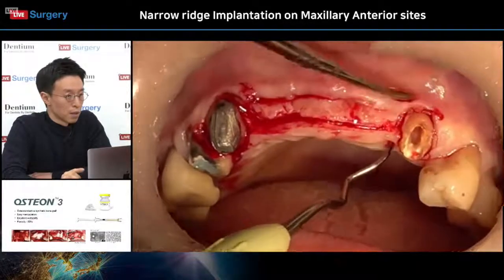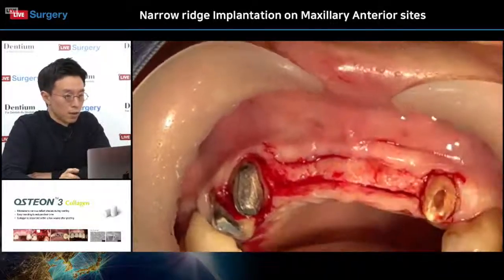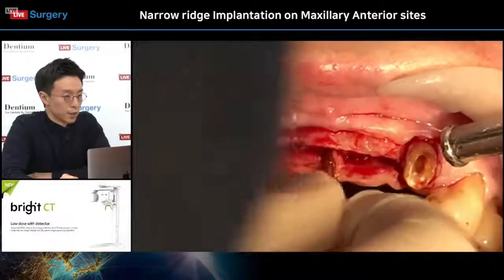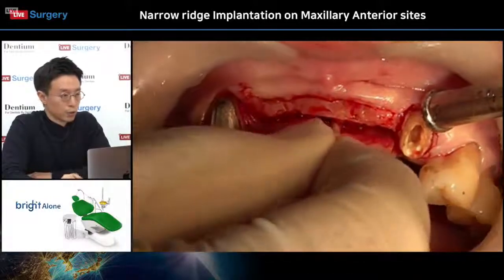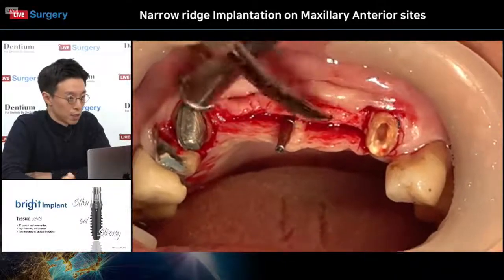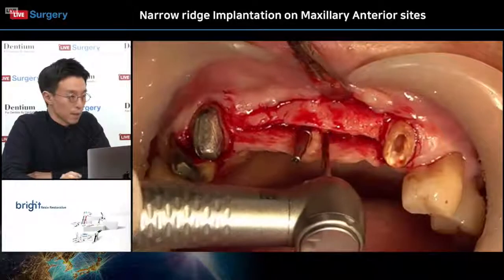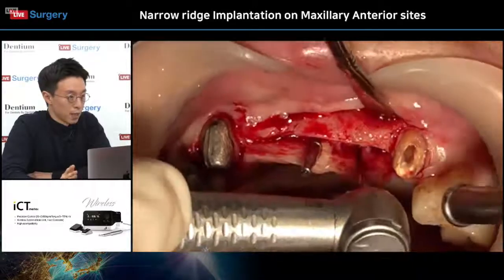He is grinding the bone around the left upper canine area. Since the left upper canine will be restored with a new crown, he would perform crown lengthening. And he inserted a pin at the mid area.